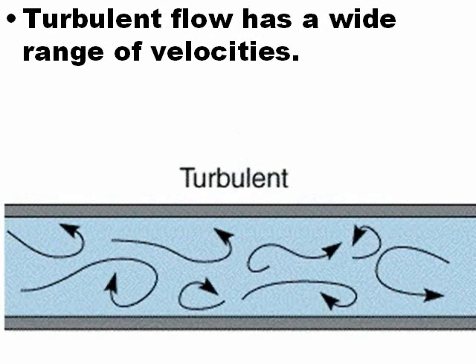But turbulent flow, which is not normal, is when the blood is moving at different velocities and in different directions. This is what happens after a stenotic area. Flow is moving at different velocities and in different directions.